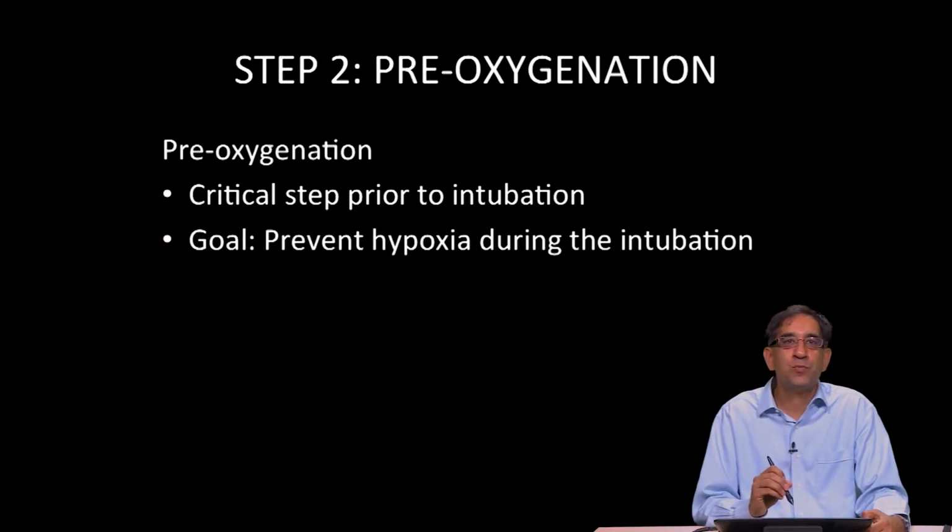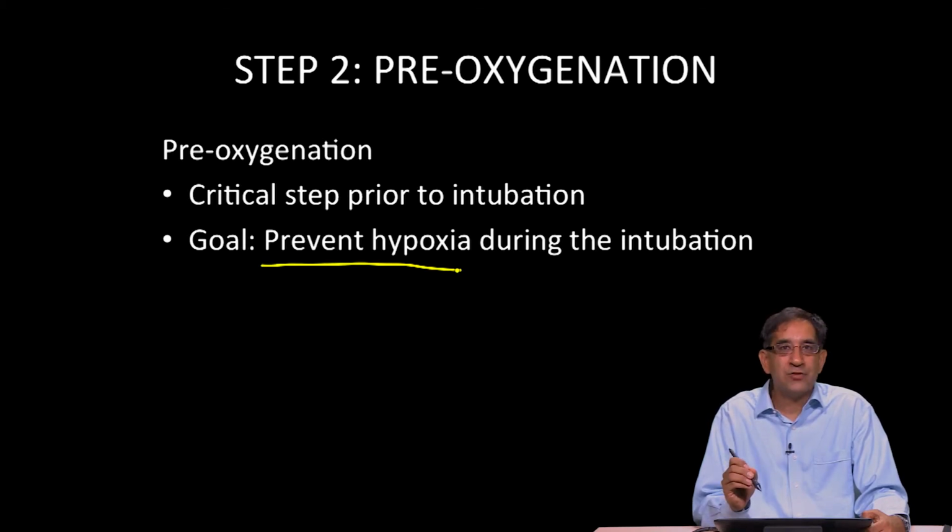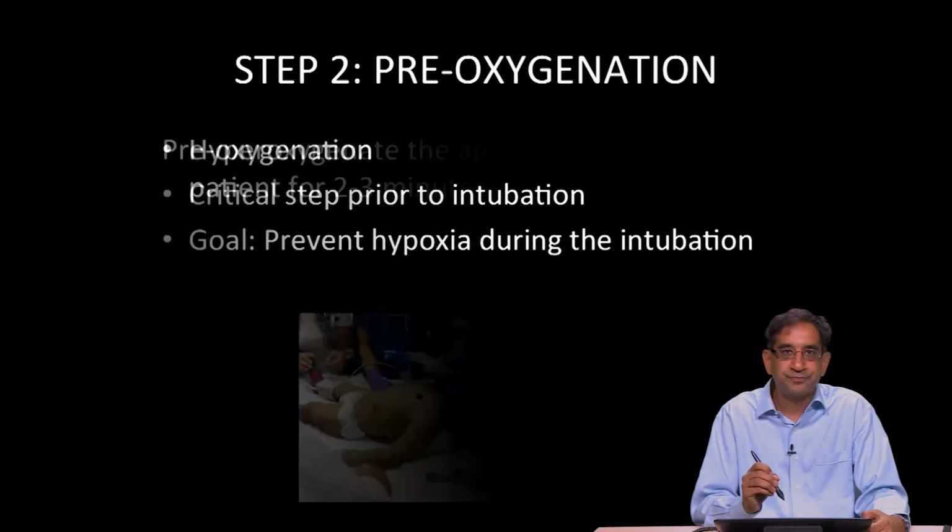Step number 2 is pre-oxygenation. This is a critical step prior to intubation, because while you're intubating the patient, generally you are not providing ventilations, and so your goal of providing pre-oxygenation is to prevent hypoxia during the procedure. And how do we do this? Basically, we want to create a reservoir of oxygen within the patient's lungs by washing out all the nitrogen and creating this reservoir of 100% oxygen from which the patient can draw during the procedure.